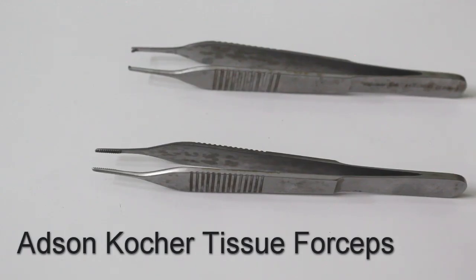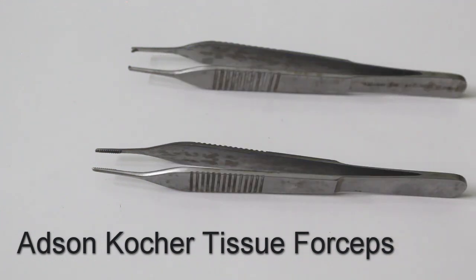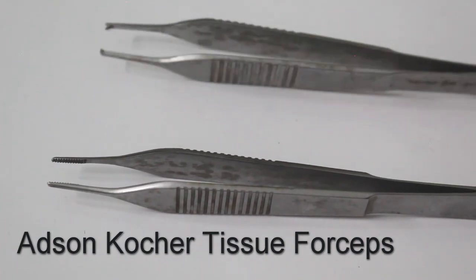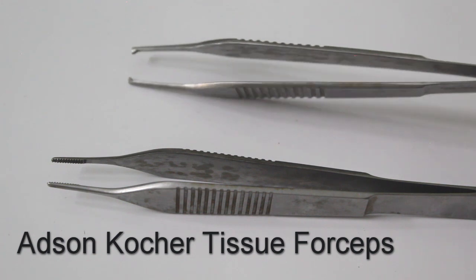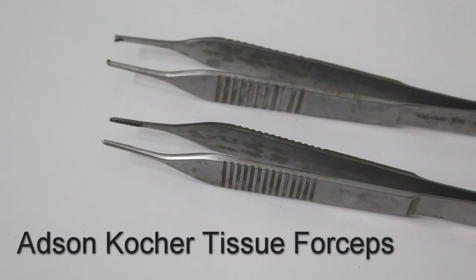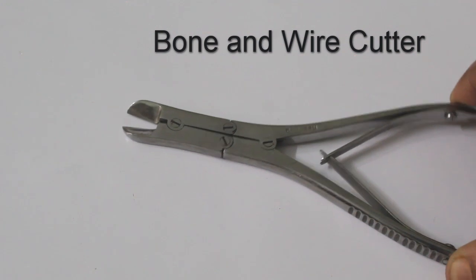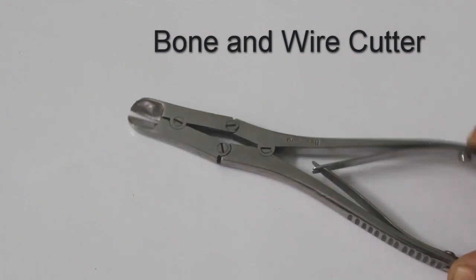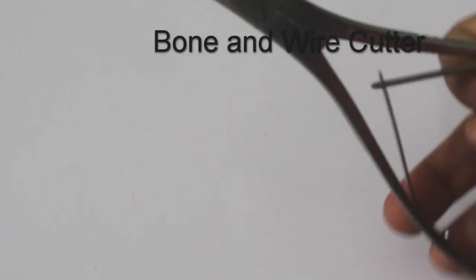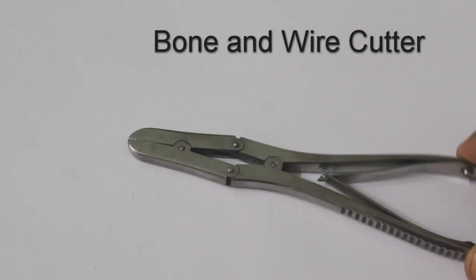Micro-Adson forceps — with teeth and without teeth. Both are used for handling very delicate tissues during rhinoplasty surgery. You can see the teeth at the tip. The other one is an Adson forceps without teeth. This is a wire and bone cutter with a double-action plier mechanism, and it is sometimes used in rhinoplasty to remove bone projections.